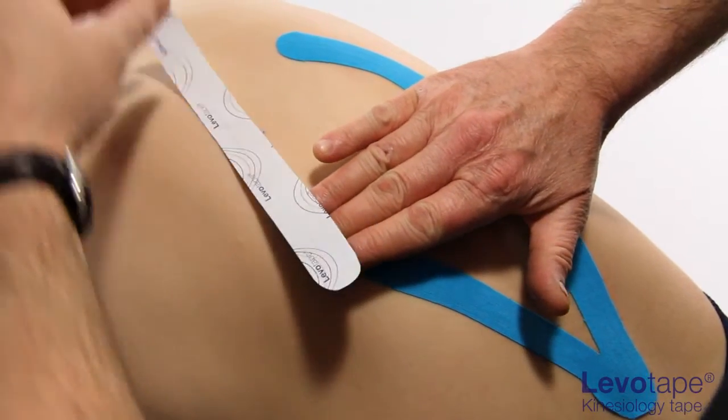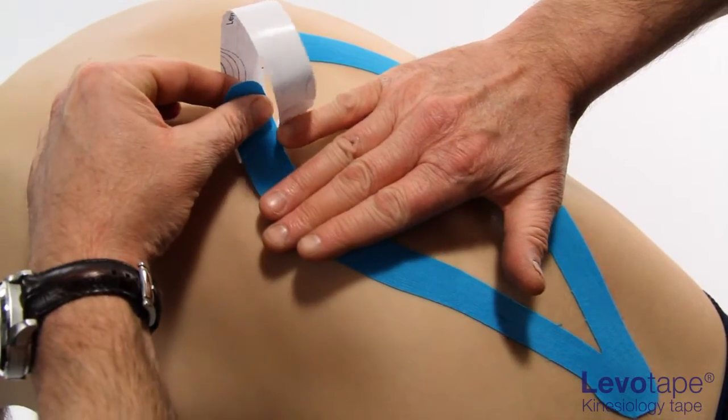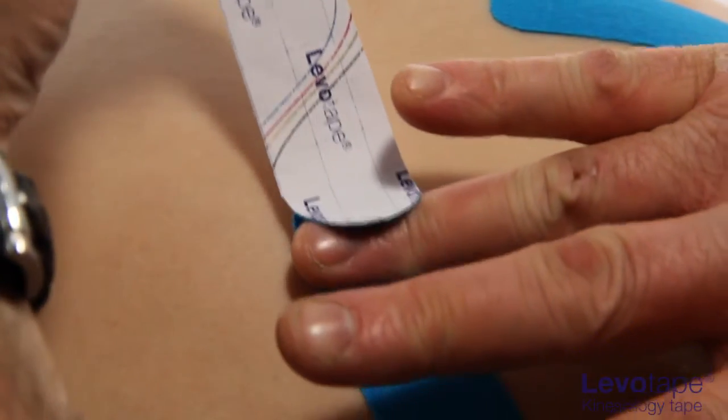Lay the second tail along the natural curve of the muscle belly, again with absolutely no tension.